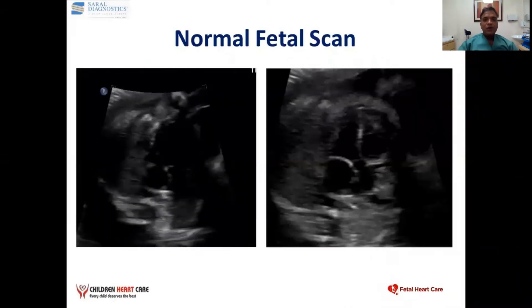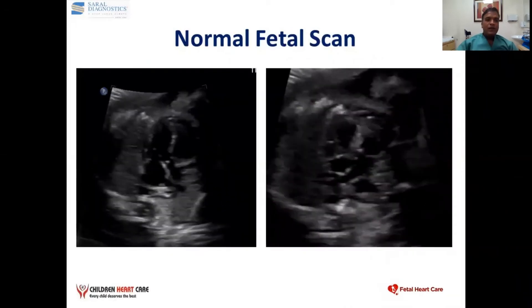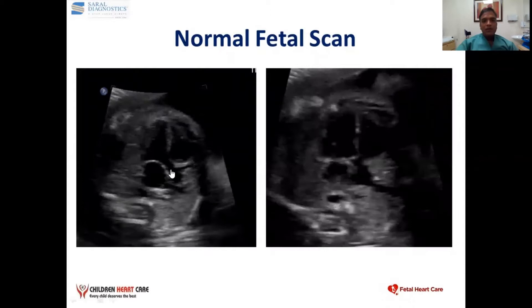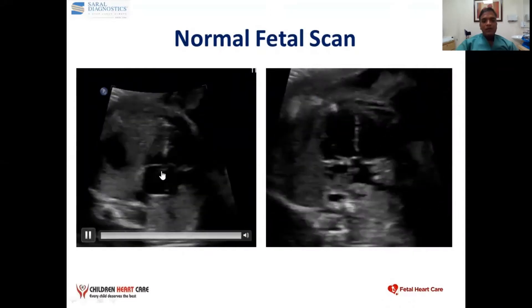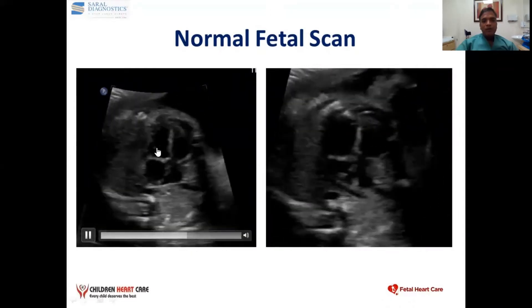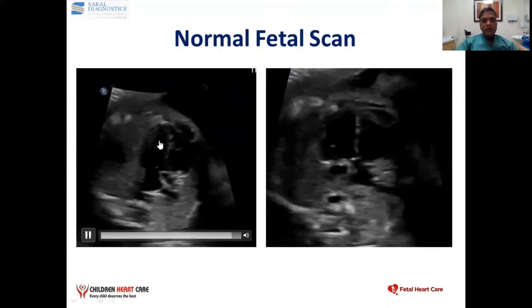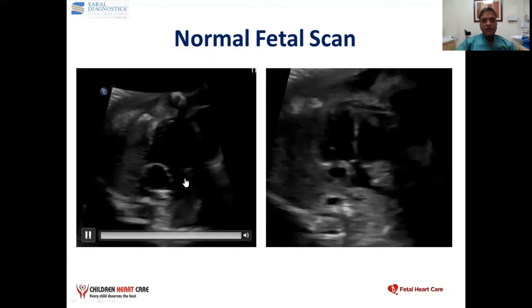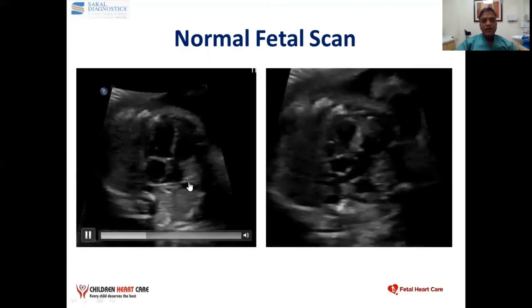First I will describe a normal fetal scan. Normally there are four chambers: the left atrium, the left ventricle, right ventricle, and somewhere here is the right atrium.